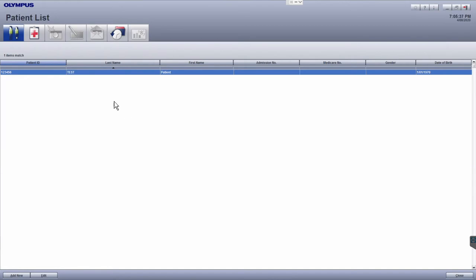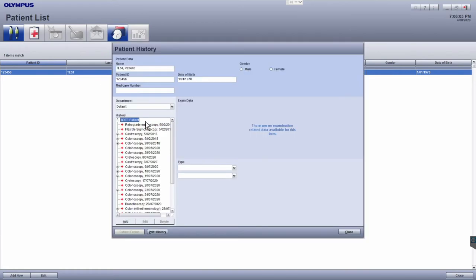This will bring up the matching patient record for that patient. Make sure that this patient record is selected and then click on the patient history module button. A window with the patient history will pop up.